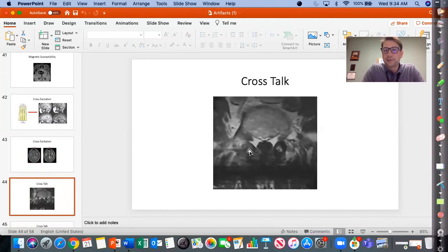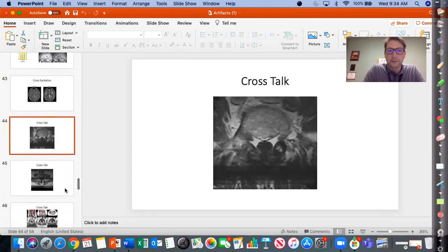Oh, here is an example of crosstalk. Here, that band is going right posterior to the spinal canal. Here, I would say that you might have to repeat this one because it's getting a little too close for comfort for me, and it's getting really close to that posterior spinal canal. It's really covering up that spinous process. I would go ahead and repeat that sequence.